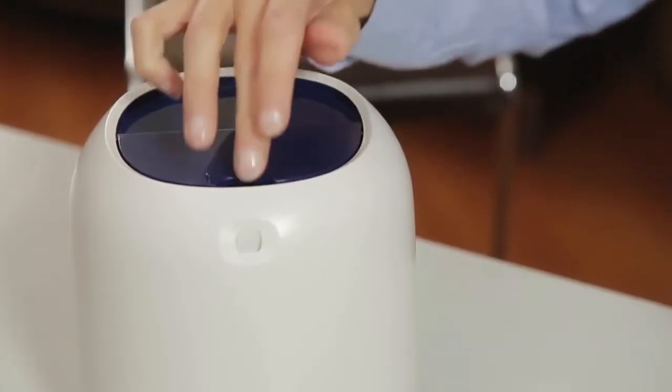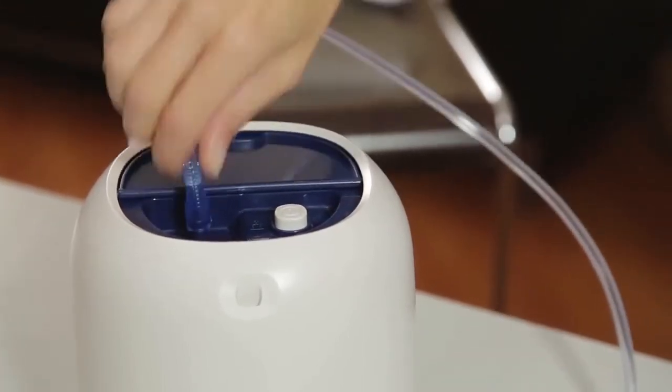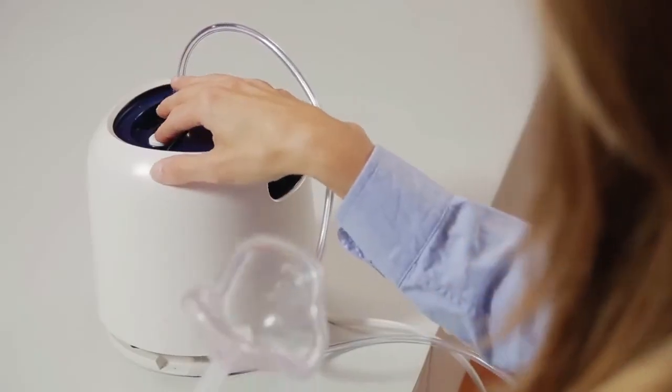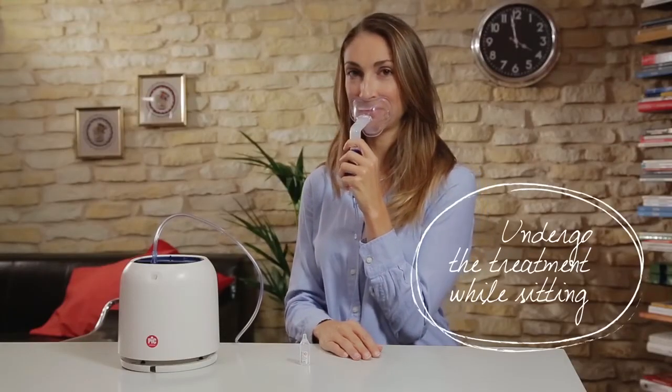Lift the device cover forward and connect the nebuliser tubing to the air outlet connector. Turn the device on to start the treatment. Remember, it's best to undergo the treatment while sitting in a relaxed, upright position.